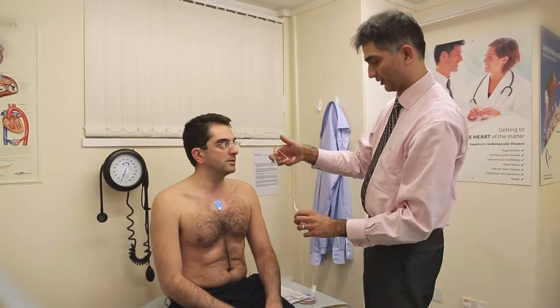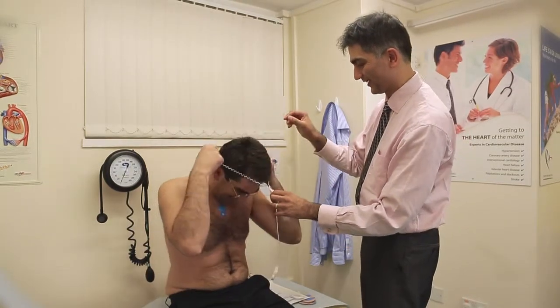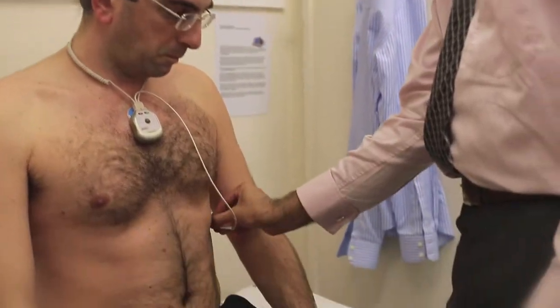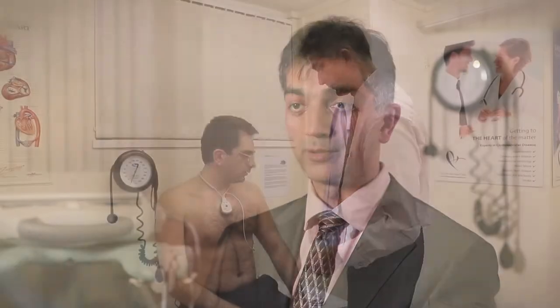One would expect the heart rhythm to be slow and regular at night when the patient's asleep and to be fast and variable during the day. If the patient's getting dizzy spells or is feeling faint and if those symptoms are due to an abnormal rhythm of the heart, we should be able to pick that up on the monitor.